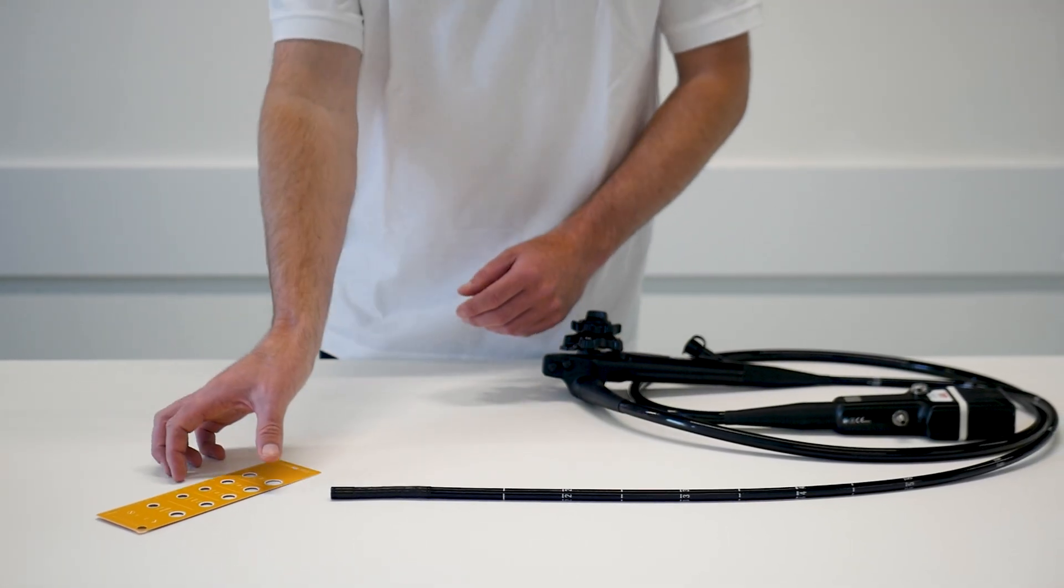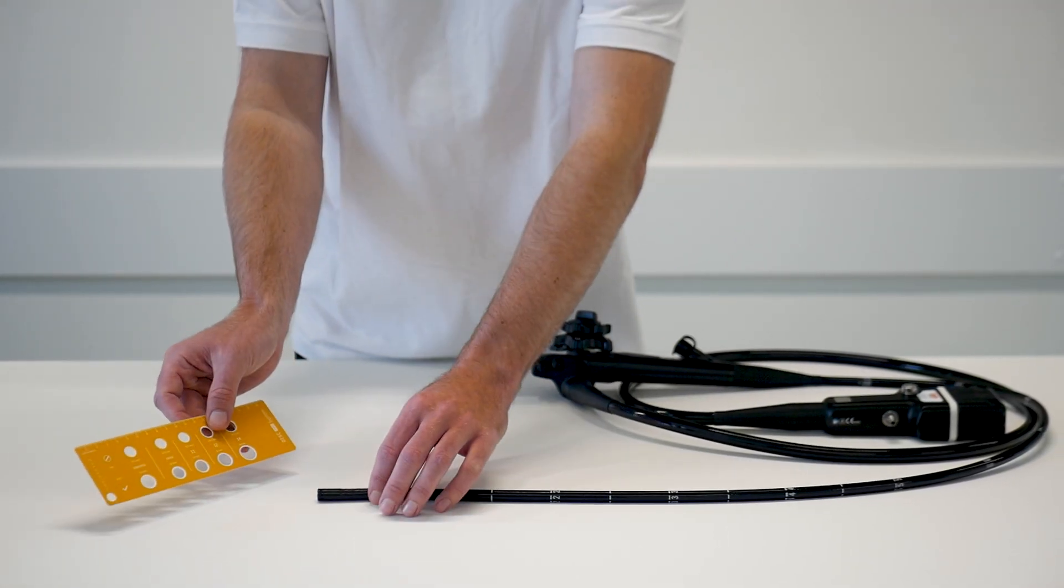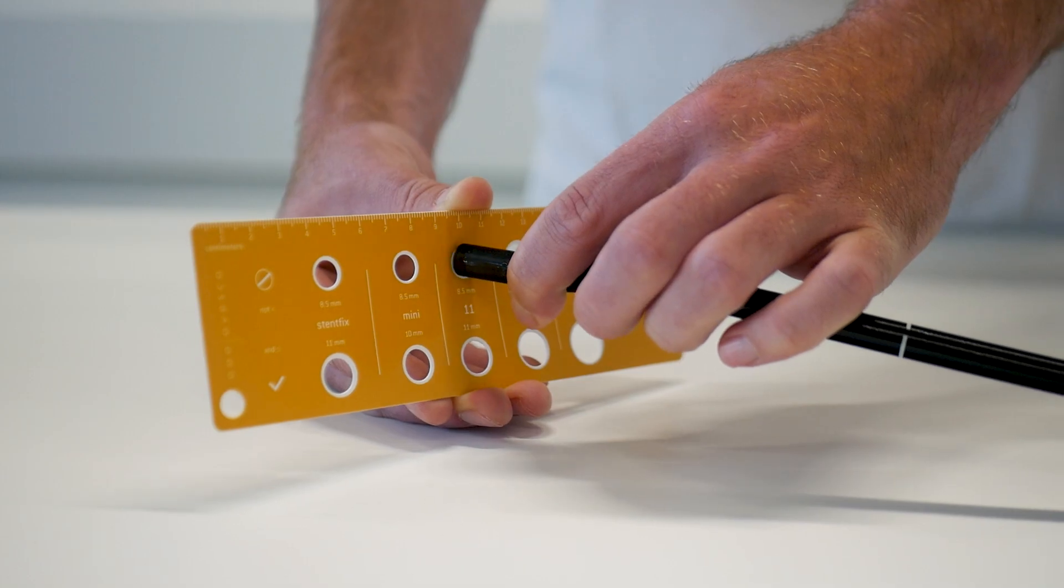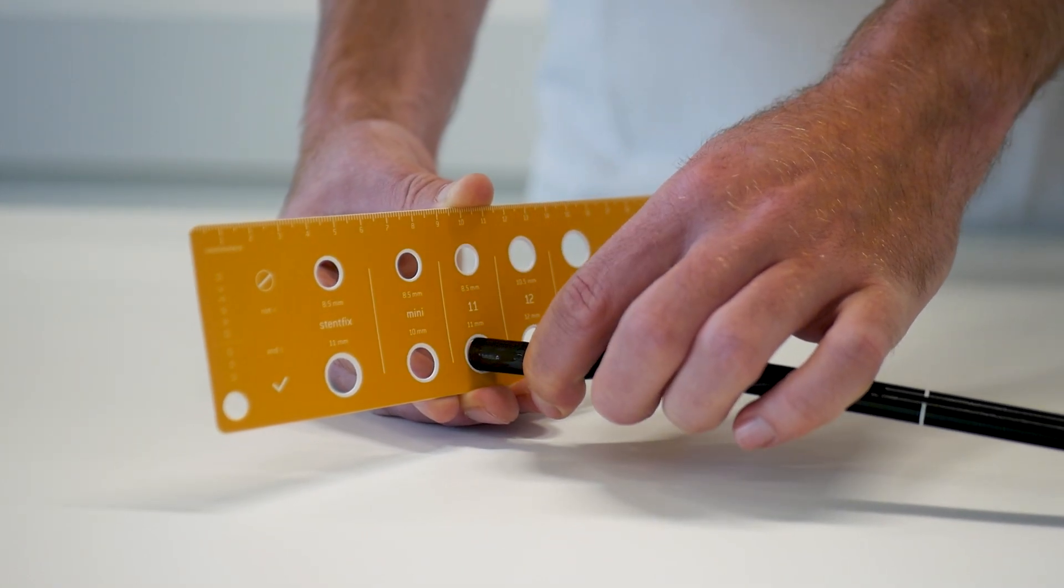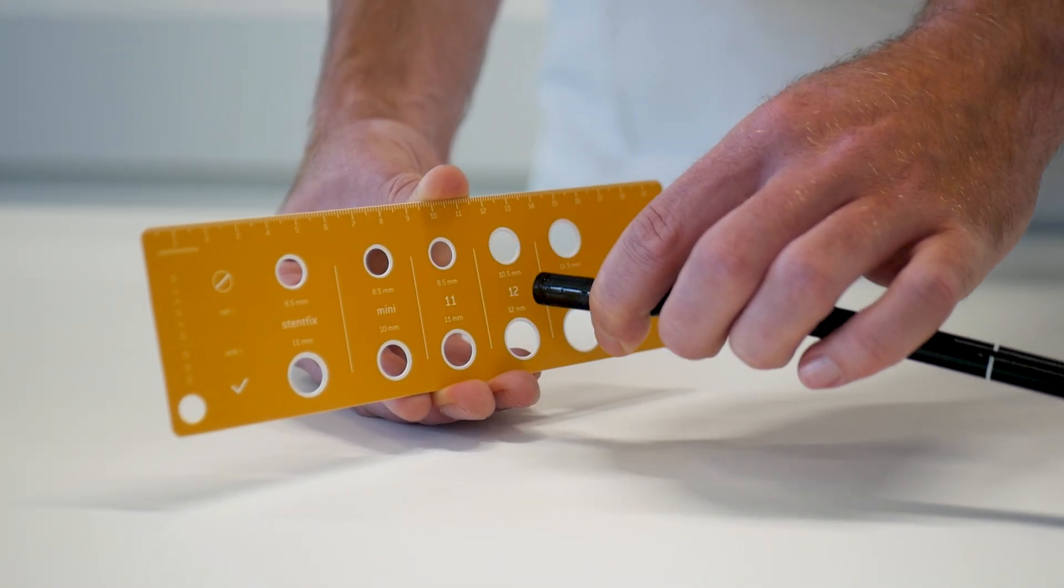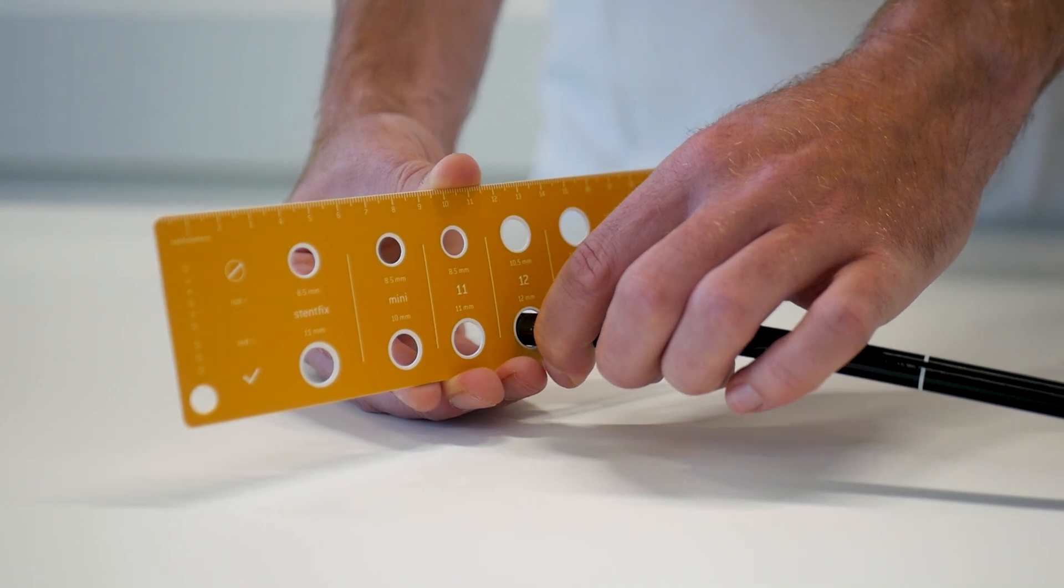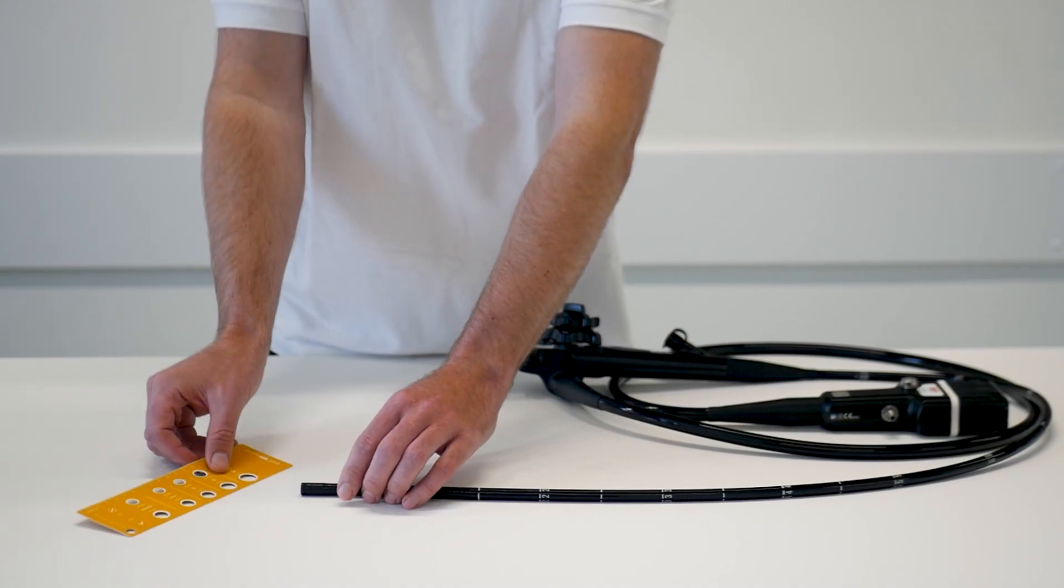Before use, check the compatibility of the endoscope and the application cap using the scope check. The endoscope is compatible if it is too large for the upper opening but fits through the lower opening. This step is particularly important as endoscopes often deviate from their specifications.